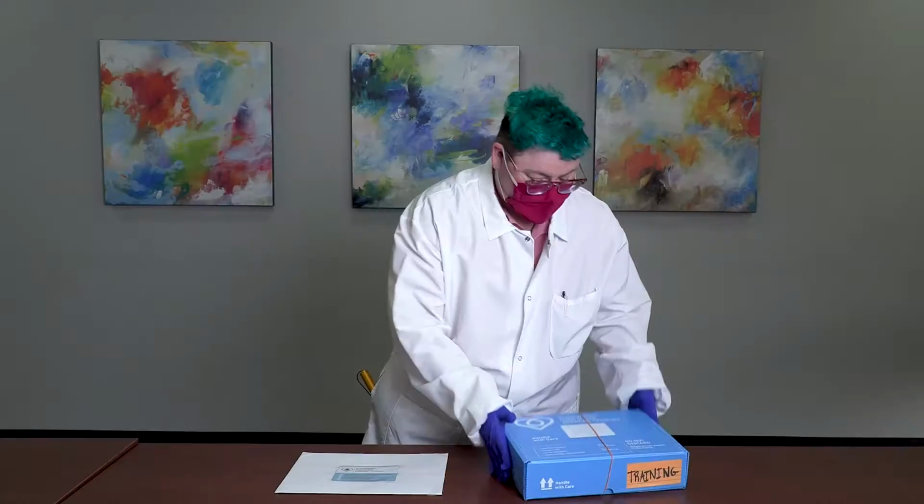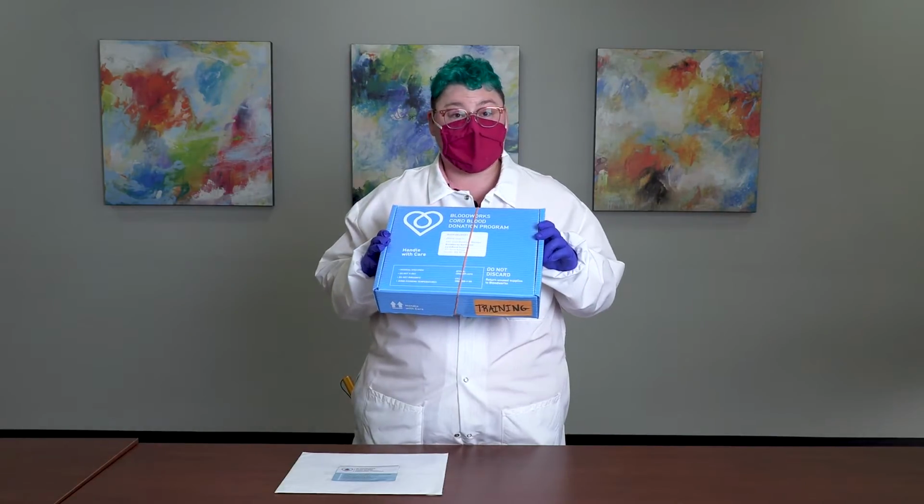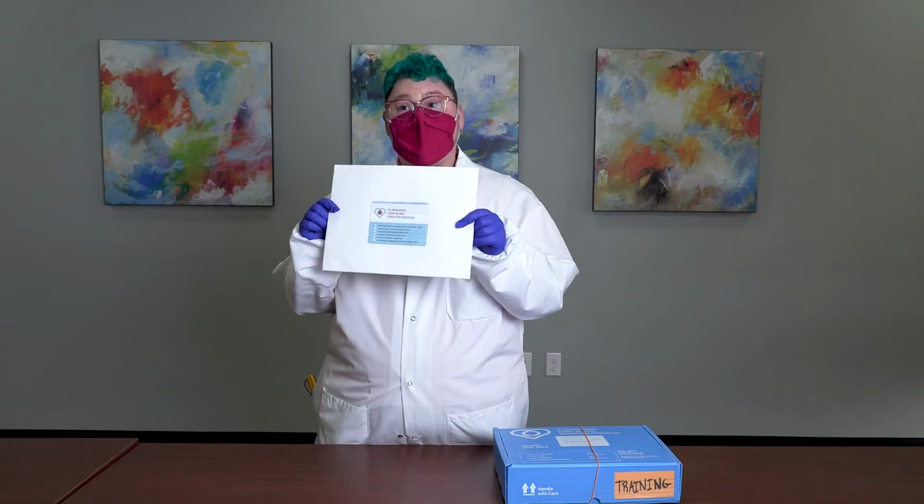When you're ready to do your cord blood collection, you'll need to collect two different items. The first is the cord blood collection kit. This is stored in the storage room in labor and delivery of all of our participating hospitals. While you're in the storage room, you'll also need to grab an admit packet.